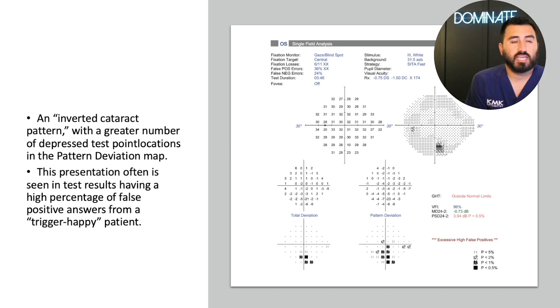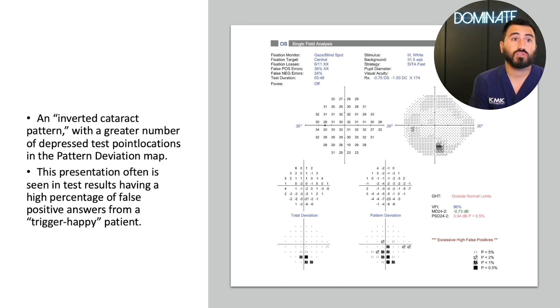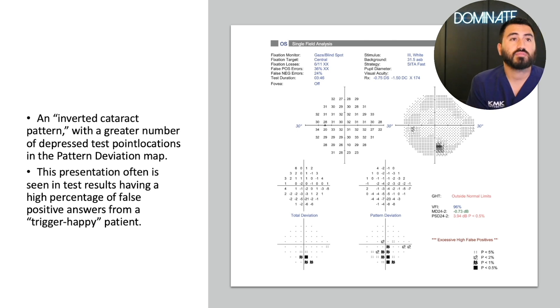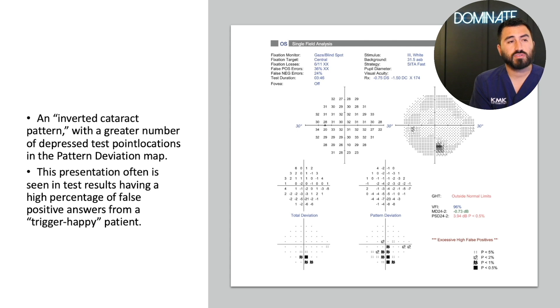This is called an inverted cataract. An inverted cataract means on the pattern deviation, you have more spots than the actual total deviation. If you look at false positives, you'll see that the patient had false positives at 36% — this patient was trigger happy. The inverted cataract shows a greater number of points in the pattern deviation compared to the total deviation, and you're typically going to see this patient having high false positives.